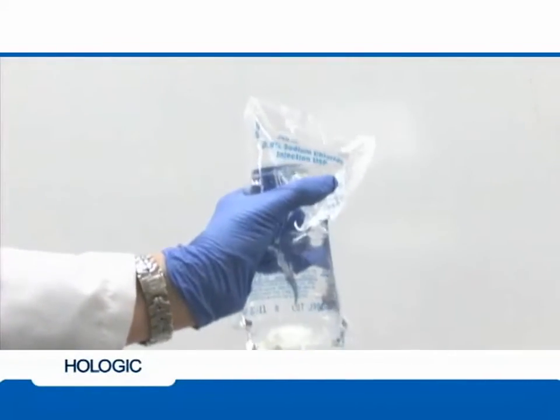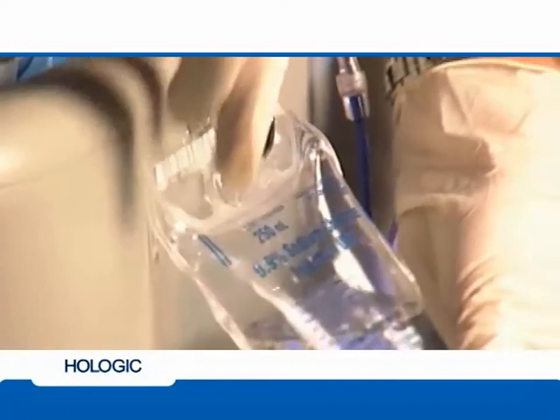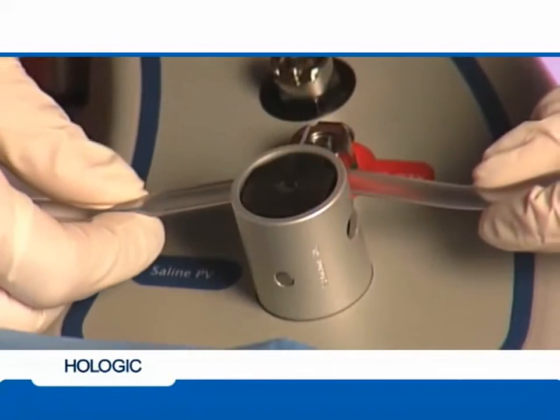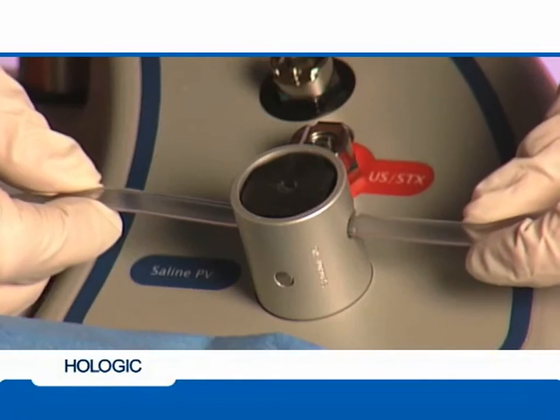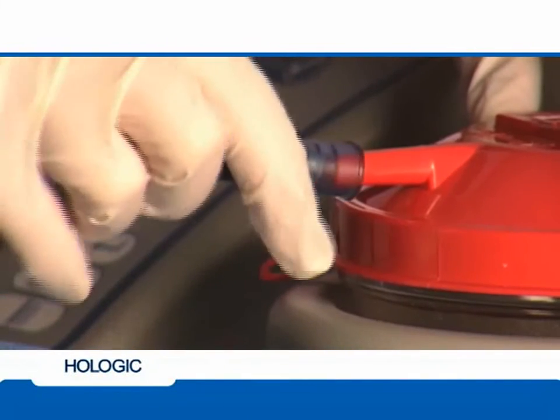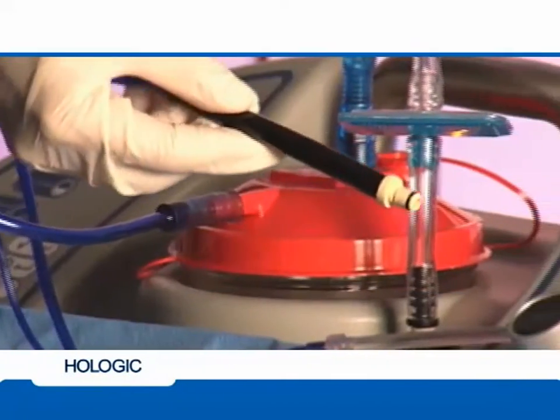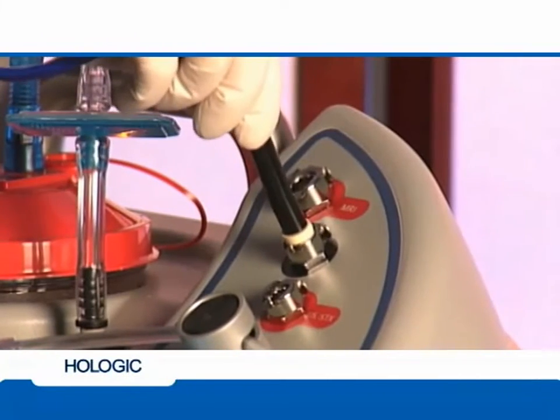Spike the saline bag. Gently squeeze the saline bag to confirm that the flow is unobstructed and hang the bag on the hook provided above the foot pedal assembly. Place the clear area of the saline tubing into the saline pinch valve. Next, locate the blue device vacuum line and attach it to the front patient port of the vacuum canister.